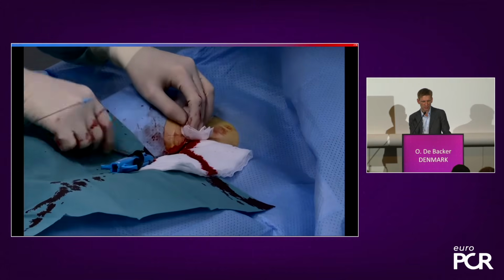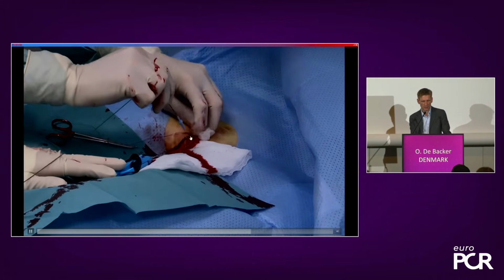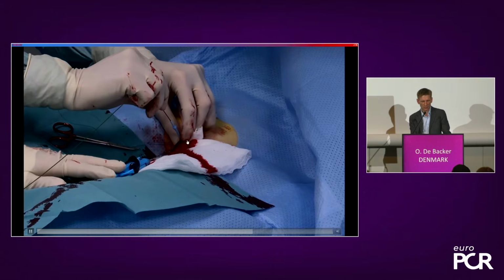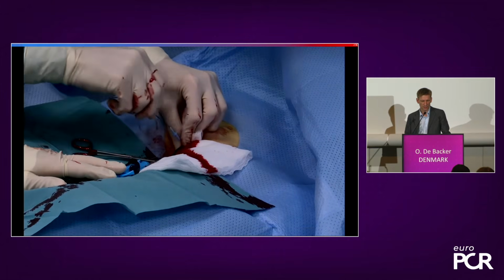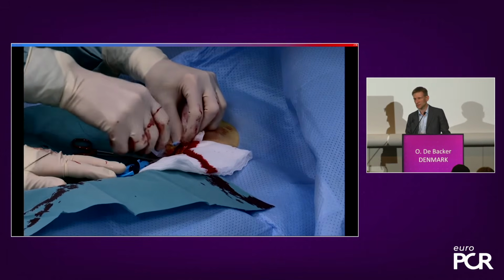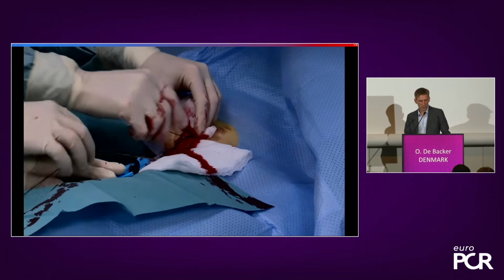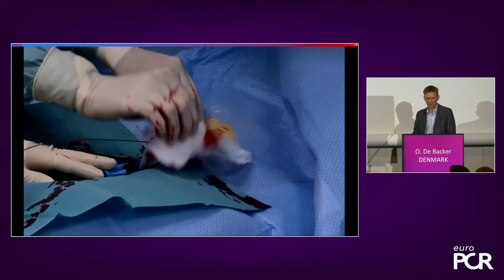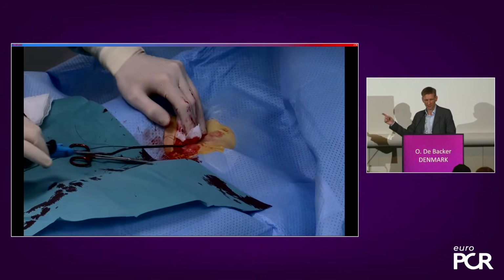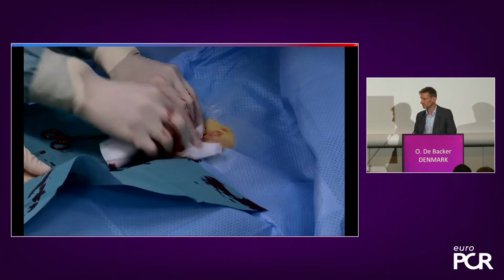Yeah, so now you see this hub here with the white indicator, and now the wire goes in. That could be either the short wire again, or it could be a standard J wire. So we introduce that, and then we do the same for the second Prostyle. So I think that's what I wanted to show in this first video, and then we can take it from there for some discussion, and we can take it to the closure at the end. So thank you so much.